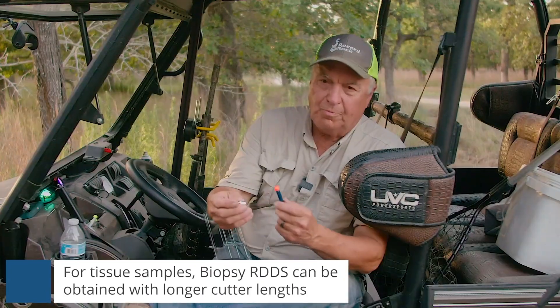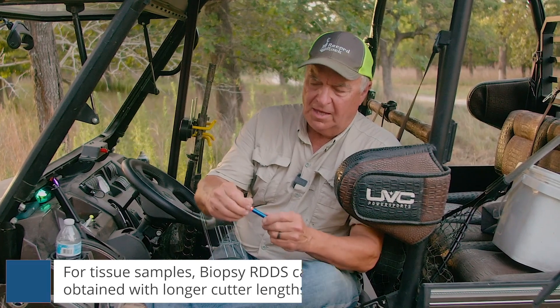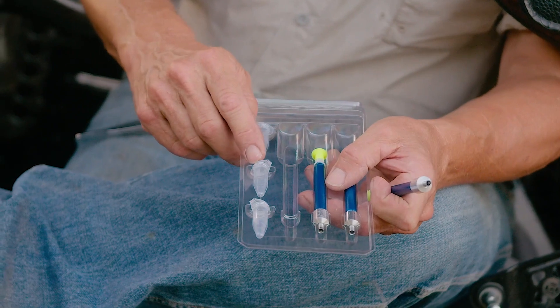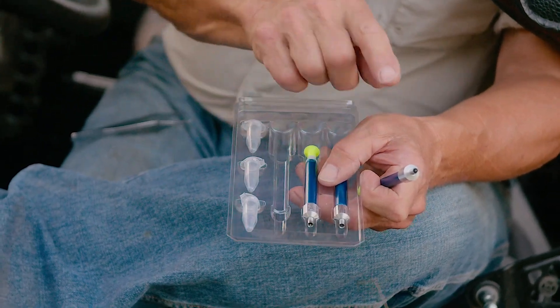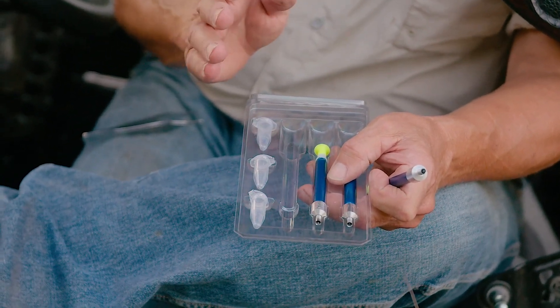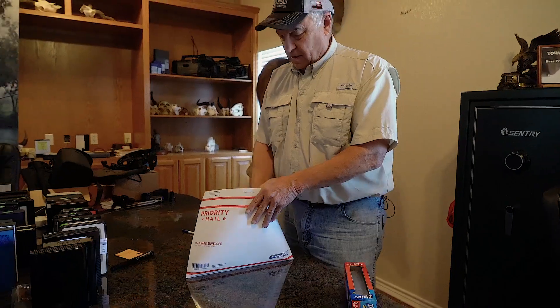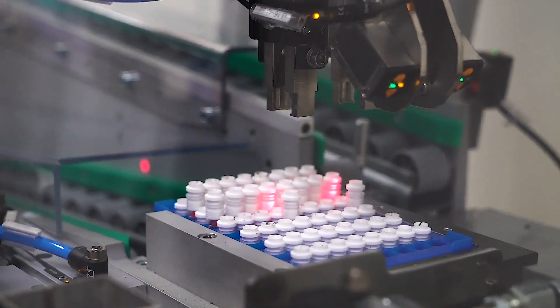Then we'll pick it up, unscrew the end of it, and in the package come these neat little vials — one for each one of these darts. We take the sample off the dart and put it in the vial. You want to make sure and have isopropyl alcohol to put inside that little container just to preserve it.